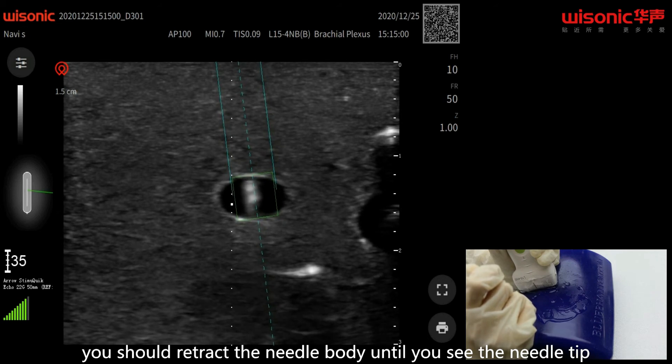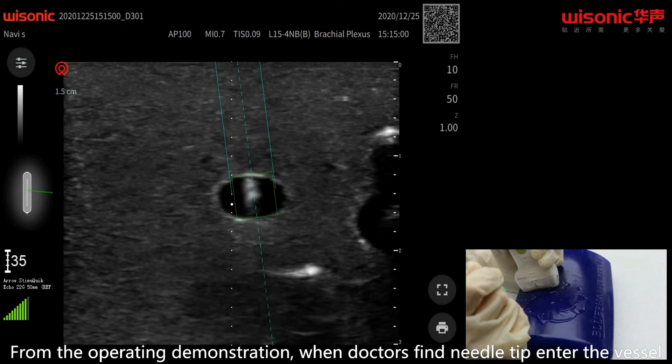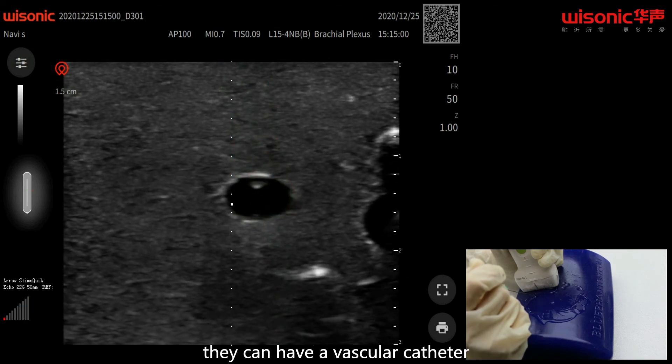You should retract the needle until you see the needle tip and the target box turns green to red. From the operating demonstration, when doctors find the needle tip entering the vessel, they can have a vascular catheter.